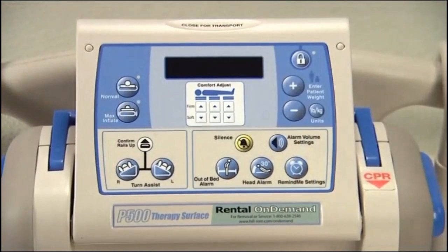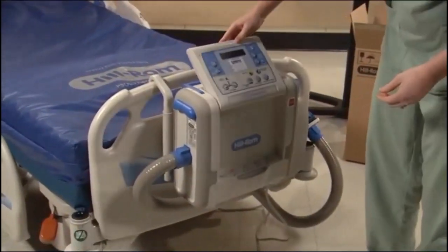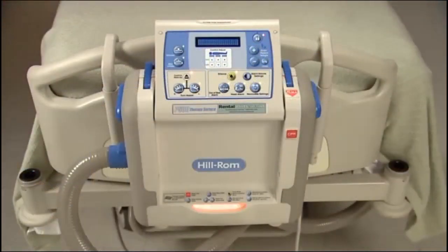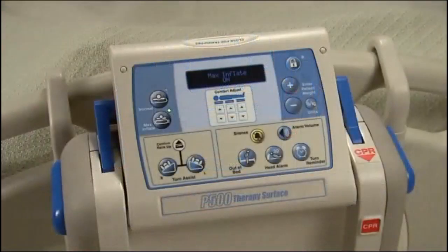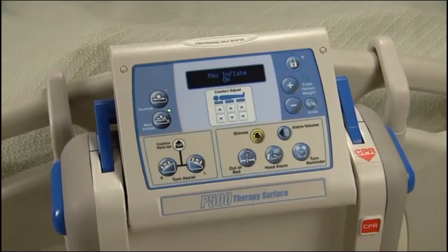Next, we will explore the controls on the air control box. With the air control box properly in place and connected, we can flip up the display screen and turn on the power. The controls are grouped into 3 separate areas. The upper portion adjusts the surface in terms of comfort settings.